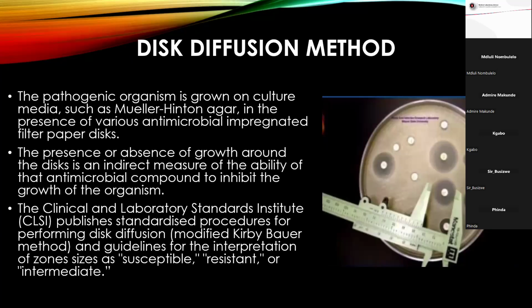The most standardized method in disk diffusion is the Mueller-Hinton agar, which is usually referred to as the Kirby-Bauer method, useful in most bacterial types, but it's not useful in some bacteria. Like Neisseria gonorrhoeae, it won't grow on Mueller-Hinton agar, it grows on certain specific media. Streptococcus or Haemophilus influenzae also don't grow on Mueller-Hinton agar. But it's a standardized method for most organisms.